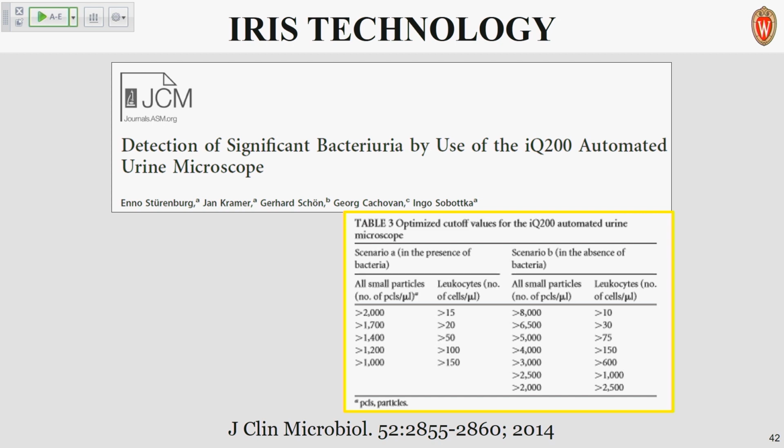Okay, so here's some primary literature that revolves around an evaluation of the iris, and basically, from my understanding, I've never used this one before, they look at a variety, three major parameters, I think.